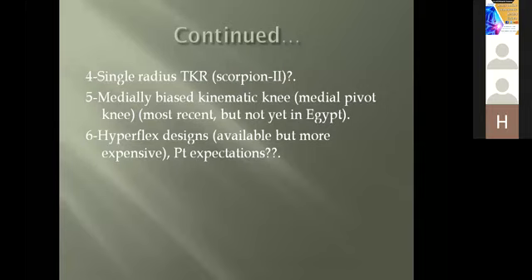Hyperflexed designs are considered and designed to allow hyperflexion of the knee in exceptional situations, and not as many doctors and many companies propagate for their prosthesis, as if it is the prosthesis of squatting or sitting cross-legged or sitting in the prayer position.